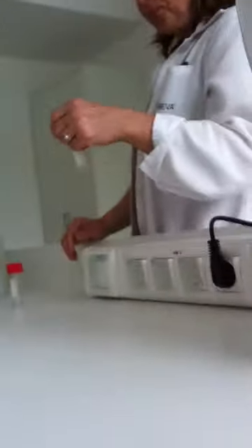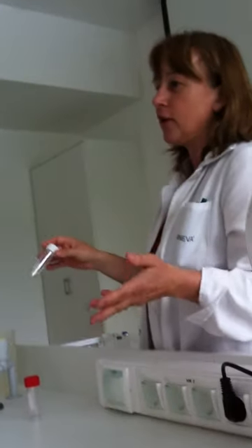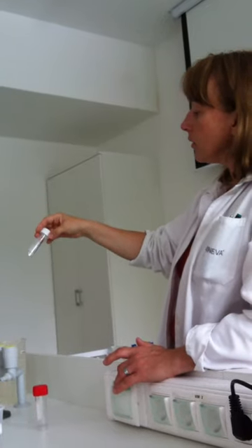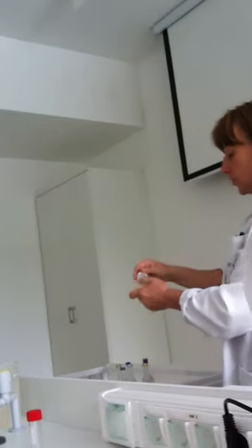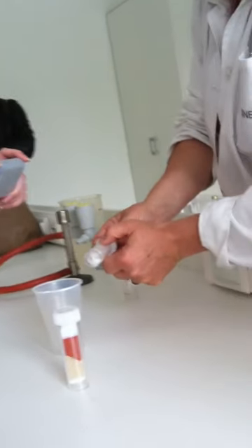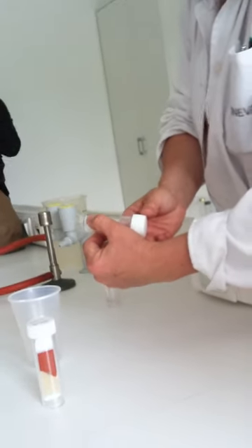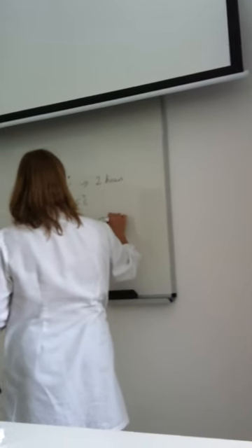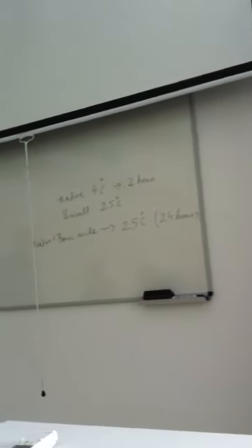Okay. There is a possibility if you have no refrigerator, or it is out of work, or something happened to your refrigerator: there is a special boric acid container with native urine. You can see in Hungarian: sterile, boric acid, urine, and the last word means container. So you can use boric acid, and this is also native. So native with boric acid, you can keep at room temperature also for 24 hours, no more, because it's a preservative, which protects the bacteria.